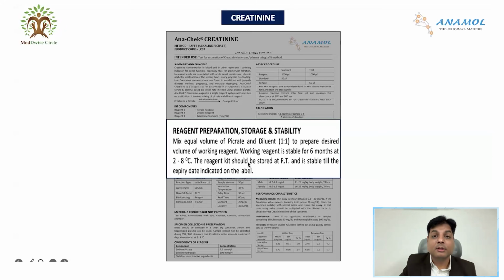And here also it is mentioned that the kit should be stored at room temperature and the kit is stable until the expiry date, which means the shelf life of the kit is, for example, 2 years. Then the kit is stable for 2 years, provided it is stored at room temperature.